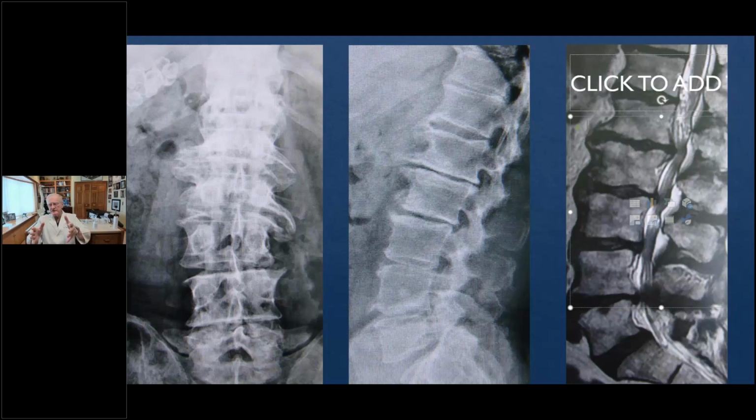So when you and I go to the instrument and we treat these spines, and you and I treat these all day, every day, am I right? This is what we do. Many of these people can tolerate lumbar roll, PA thrust. Many of them cannot. The reason, therefore, that we offer this technique, which is how I treat spines like this all through my career, and many of our people who we train and certify do this in their clinic every day. Some of these will not tolerate a lumbar roll.